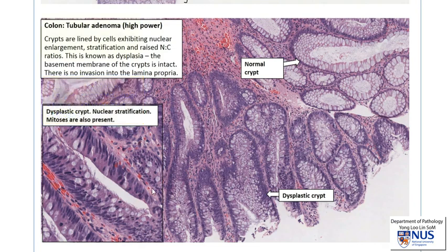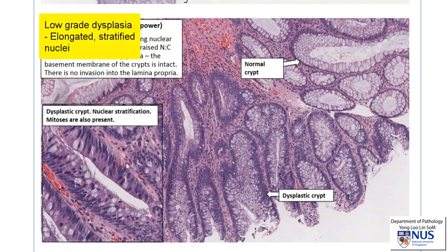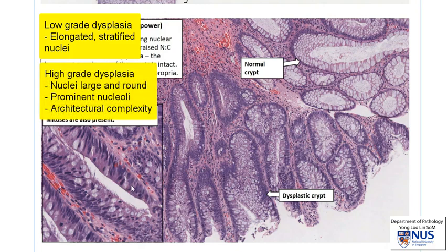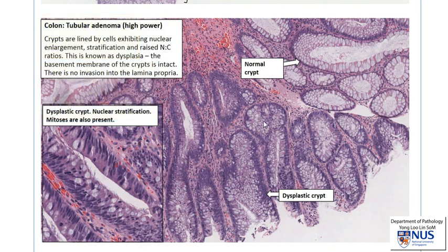We can grade dysplasia into low-grade and high-grade. Usually the appearance of elongated nuclei with some degree of nuclear stratification is seen in low-grade dysplasia, whereas in high-grade dysplasia the nuclei are rounder, they have more prominent nucleoli, and there may be more architectural abnormality in the sense that the crypts appear even more irregular and more crowded. In patients with high-grade dysplasia, the adenomatous polyps should be completely excised because there is a higher risk of progression to carcinoma if not removed.